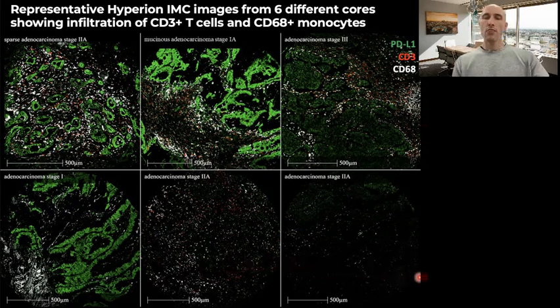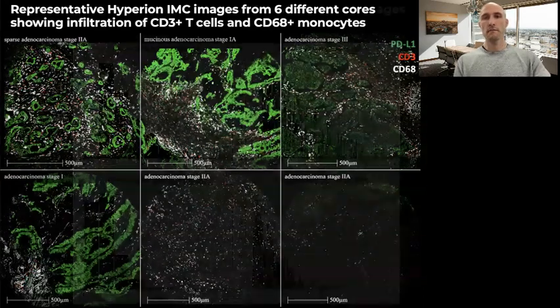Please don't forget that all this data is meaningless if you don't correlate it with the clinical outcome. To stratify patients and to decide the best treatment for each of them, we postulate that you have to look at all of this in context, paired with the clinical outcome for each of the patients.